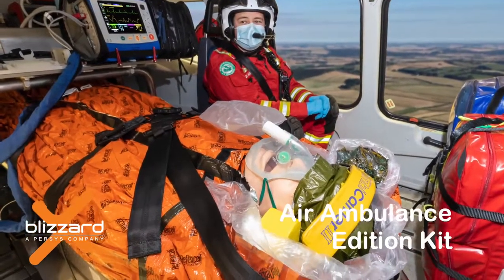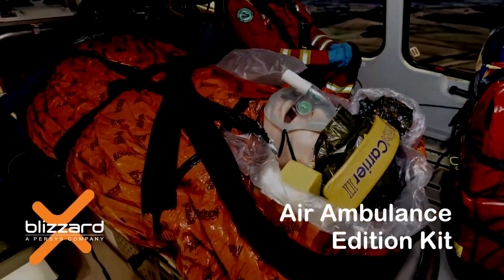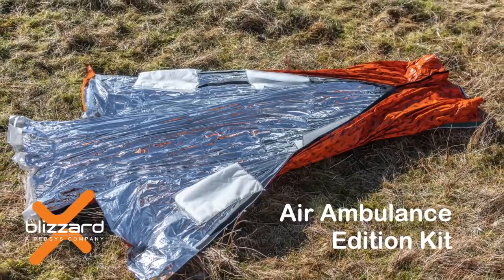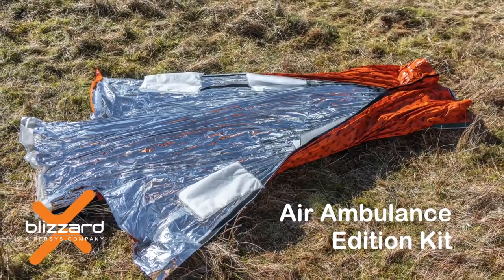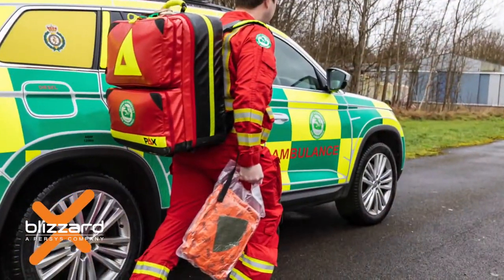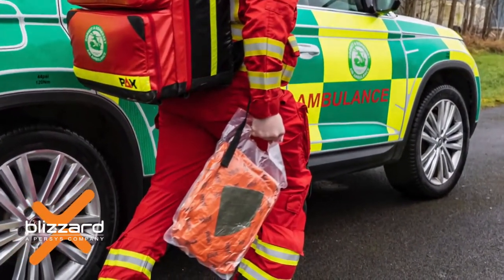Welcome to this training video for the Blizzard Air Ambulance Edition. The Blizzard Air Ambulance Edition kit includes a three-layer reflexile blanket with integral hood, a beanie hat, and four large heat pads. There is also an integral handle to allow easier carrying to the patient.